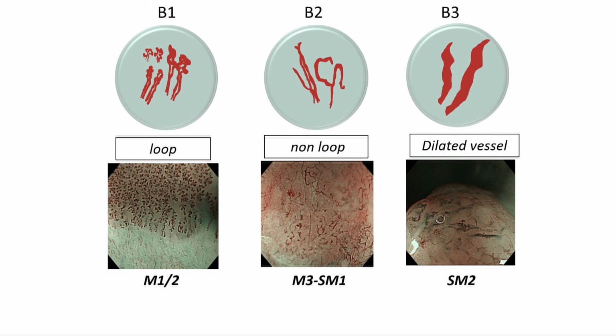What happens here, there is another concept which I didn't bring out, something called avascular areas, AVA. Once you have avascular areas, that tells us that the depth of invasion is deeper. So that is a bad sign.